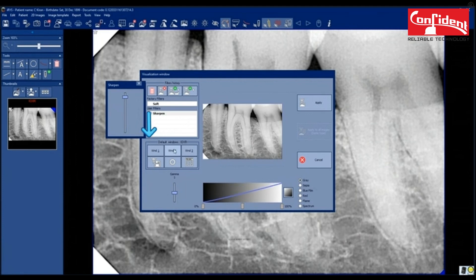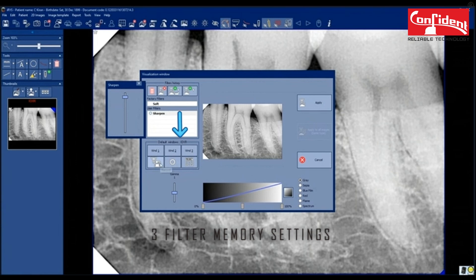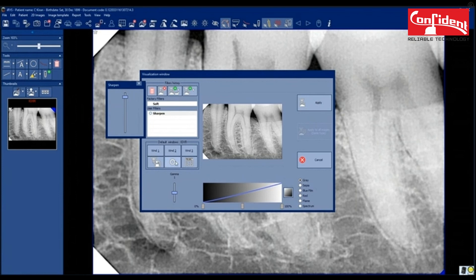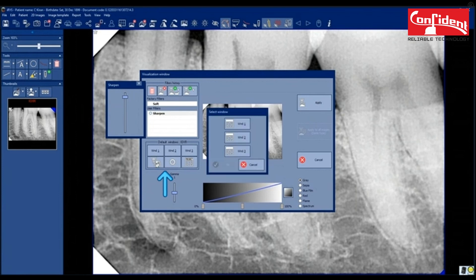There are three image edit memory settings. Make the changes and save those settings for each memory. Whenever you want to apply these filters, press on the filter memory.